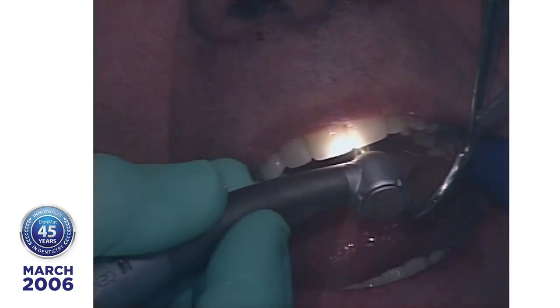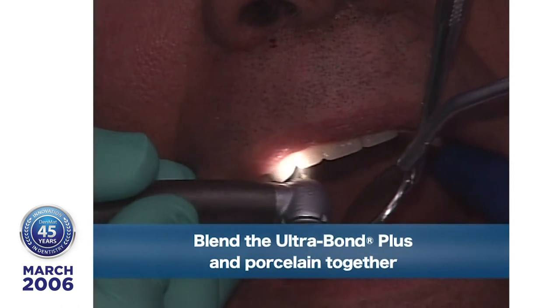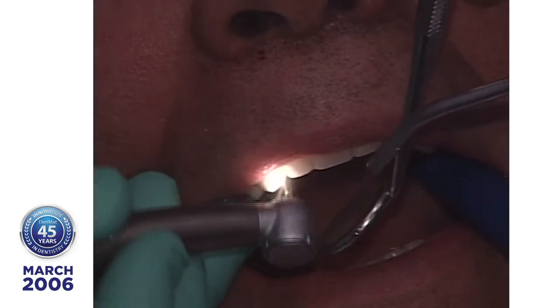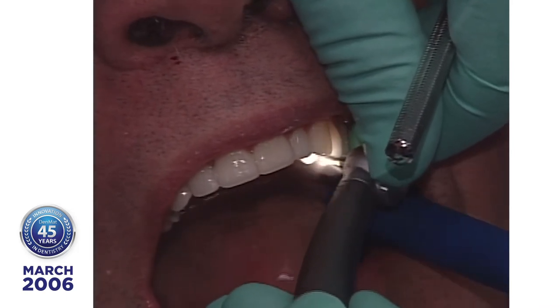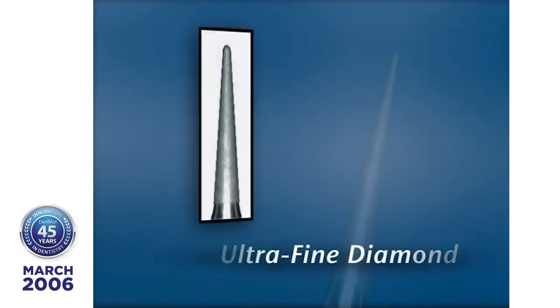The next step will be to take a football-shaped diamond, and we'll go on the lingual side and start blending the Ultrabond and the porcelain together. And what I'm doing back here that you can't see is I'm blending on each tooth the Ultrabond and the Serenade porcelain all together. They are now one solid homogeneous mass. And this is the diamond I'm using, the long, narrow, ultrafine diamond.